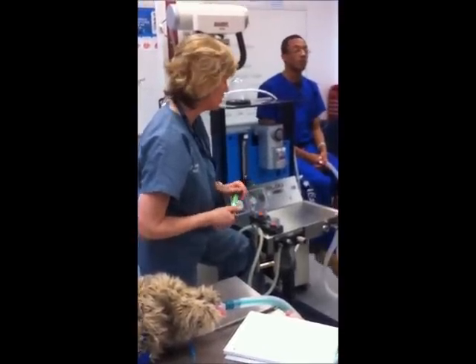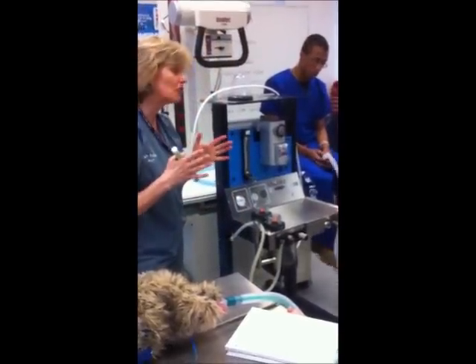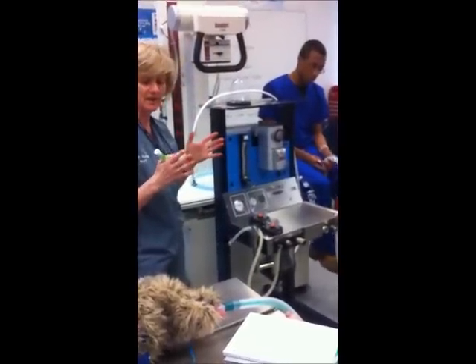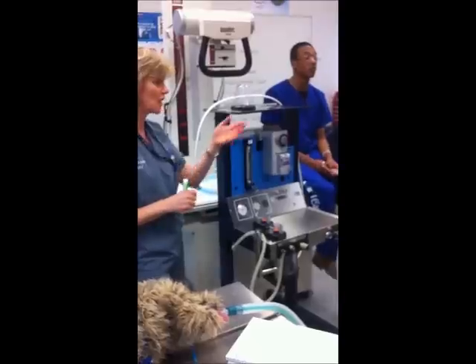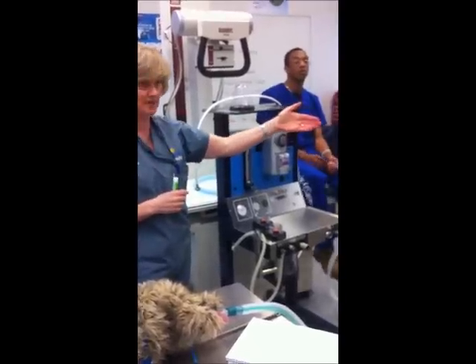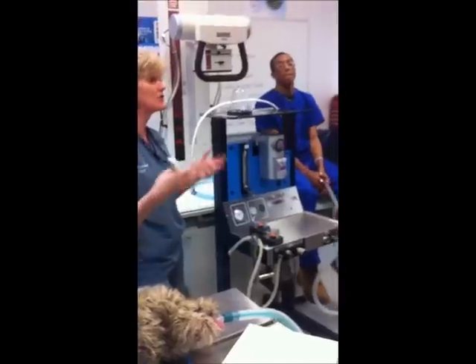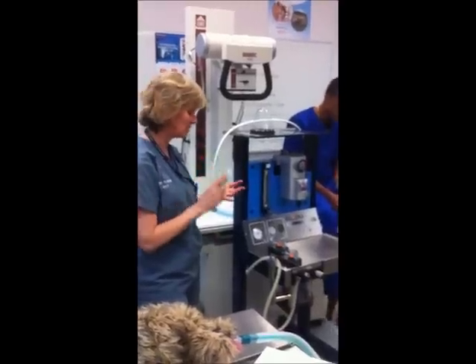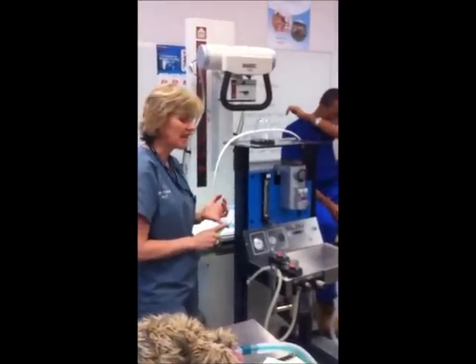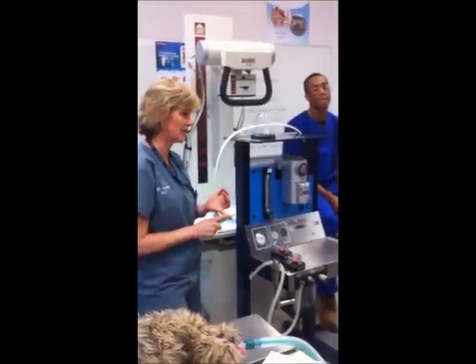You will have another station. It's a laminated sheet of paper, and there are 2 questions on it to do with induction equipment. I'm not going to give you the Doppler blood pressure and say, here, hook somebody up to it. I can't give you a pulse oximeter because I don't have one. But there'll be questions that we talked about in class. So be ready for, if an animal has hypotension, how do we treat that? That's the type of question you're going to get.